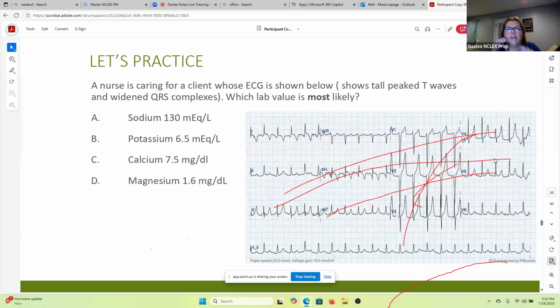So your 12 lead EKG, we put the leads on and we get an EKG, right? And it's looking at the heart from 12 different views. So that's how we can identify where that STEMI is occurring, correlating the leads to the different views and what area of the heart those leads are looking at.